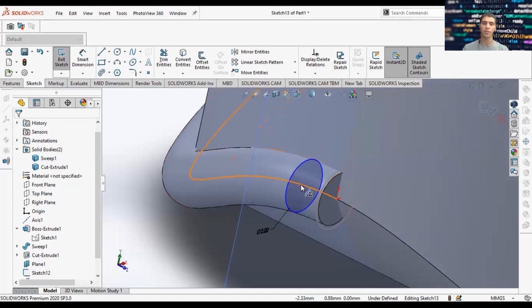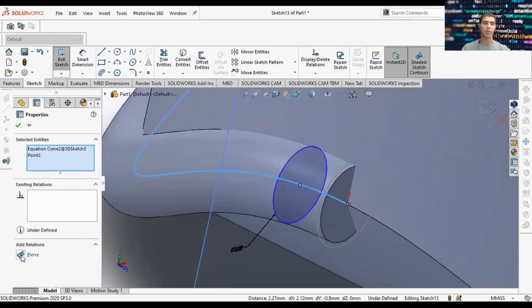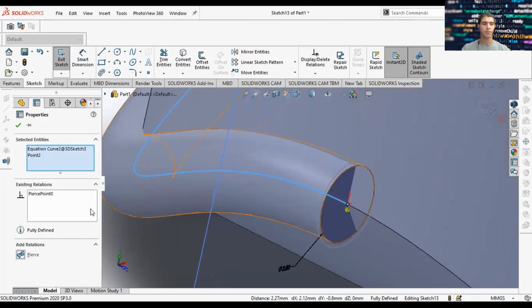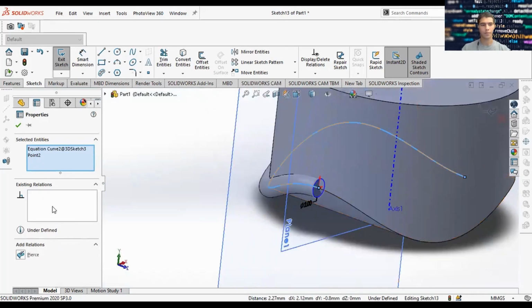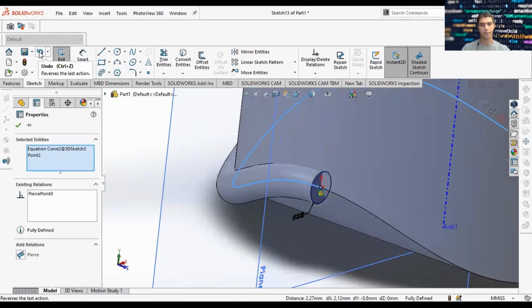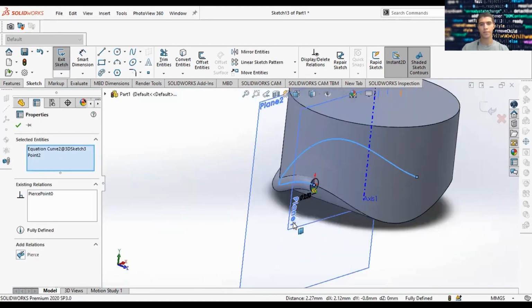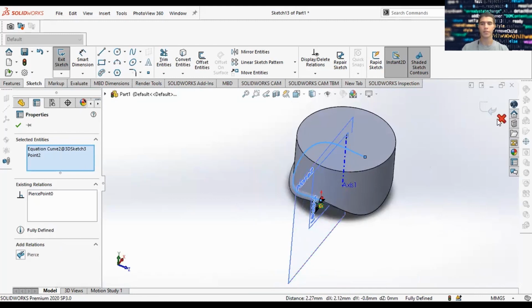And we're going to set this circle coincident to the curve, because we want it to be along the curve that we had. So we go here and click pierce. It's not the one we want. Gotcha.